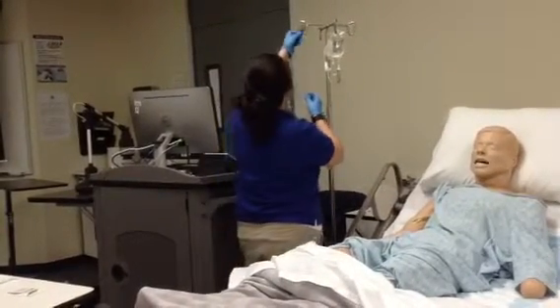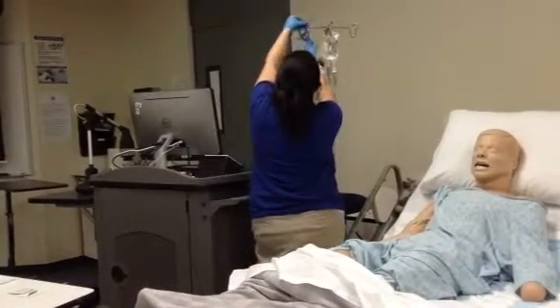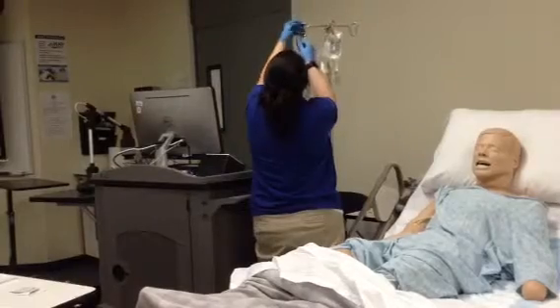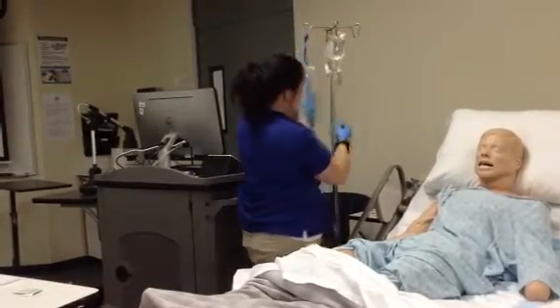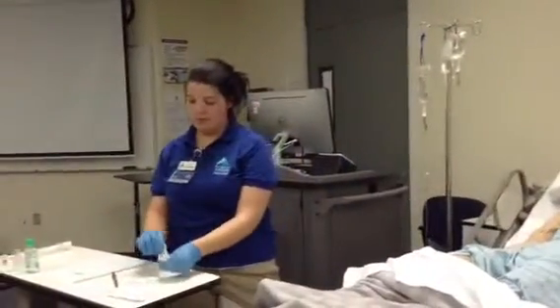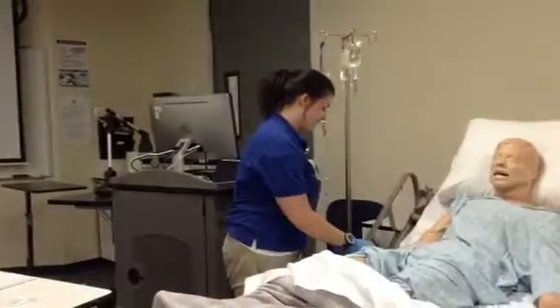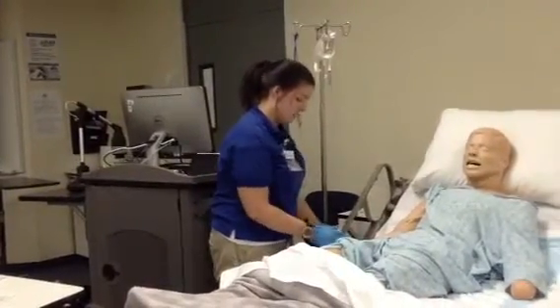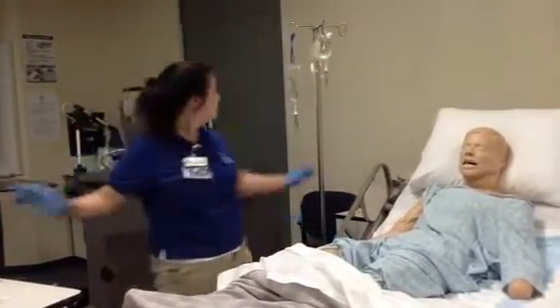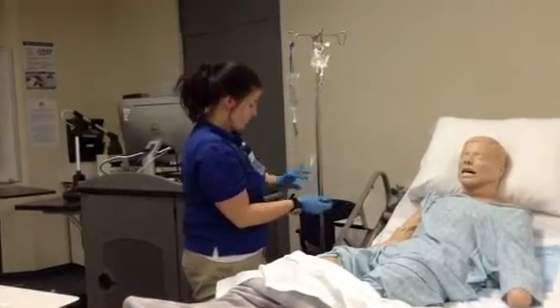And I'm going to hang my primary bag lower as it's already clamped. So where my piggyback runs, this is lowered. Okay, let me get an alcohol wipe. Okay. And I would go ahead and clean this insertion site. Okay, that would go in the trash. This down. Okay.